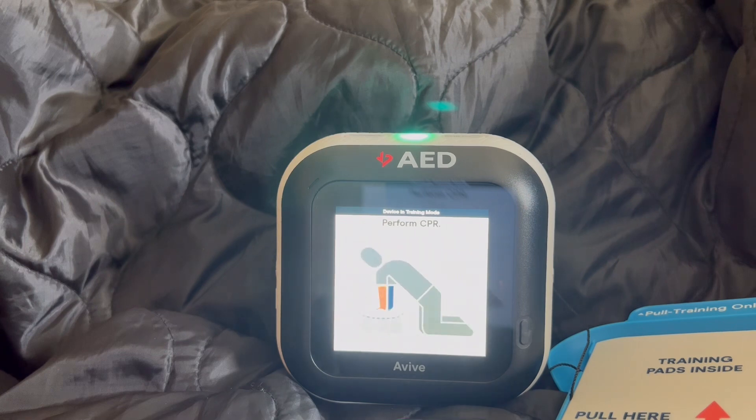Let's begin CPR. Stack both of your hands on the center of the patient's chest. If the patient is under 8 years old, use one hand for compressions. Start compressing hard and fast on each beat. Push, push, push.